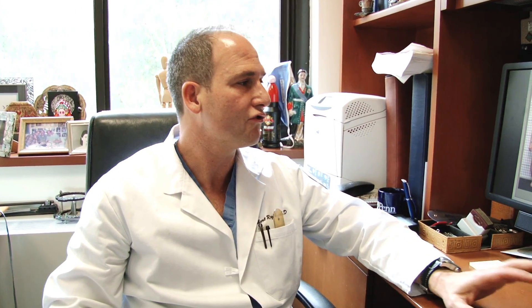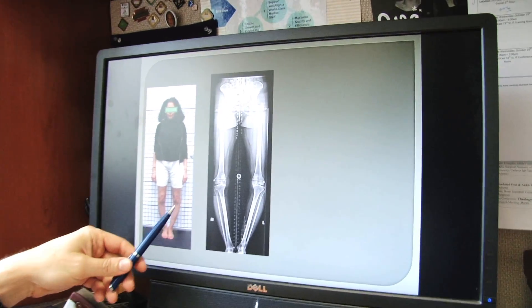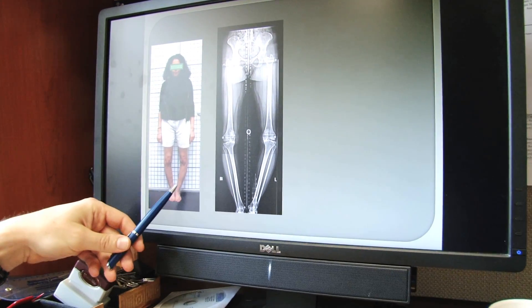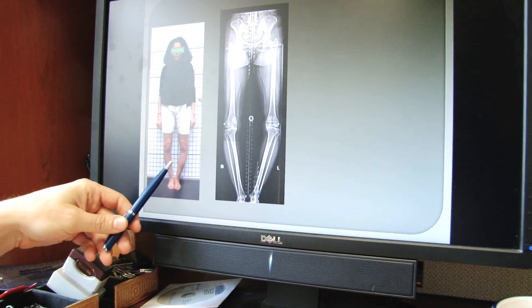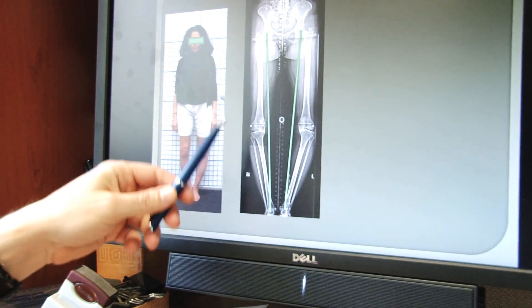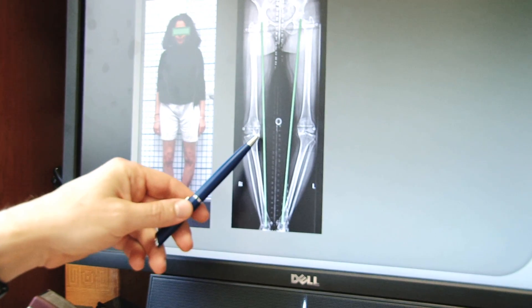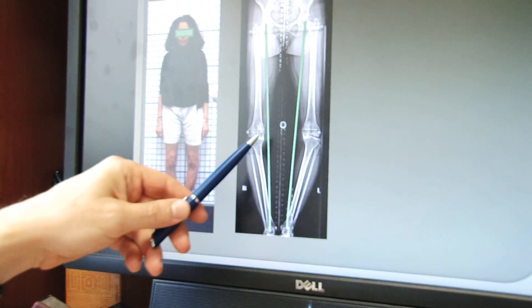I'd like to show you an example of a patient who has undergone the procedure, to get a sense of what it accomplishes and what it's like. Looking at my computer screen here, you can see this is a patient who has bow leg deformities in both legs. You can see this big space in her x-rays. The line drawn from the hip to the ankle runs very much to the inside part of the knee — it doesn't even run through the knee.